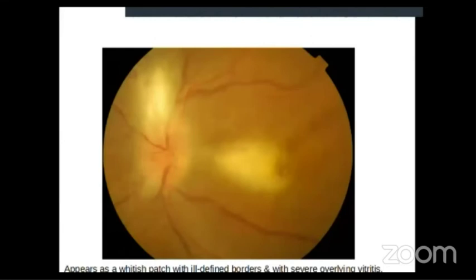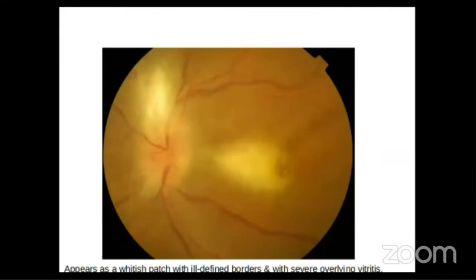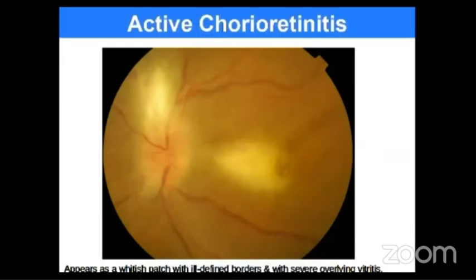In this case of toxoplasma retinochoroiditis, retinal whitening with overlying vitritis and deep choroiditis. So active chorioretinitis. It's a case of acute retinal necrosis characterized by retinal whitening and hemorrhage and vascular occlusion due to the vasculitis process in necrotizing herpetic retinopathy.